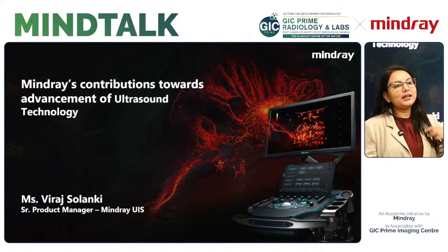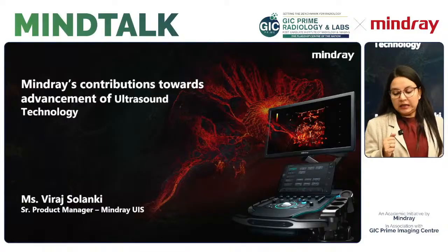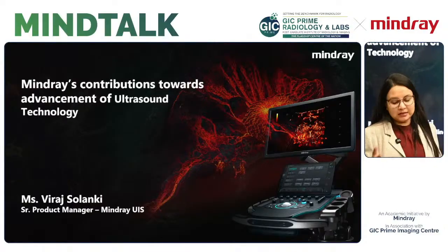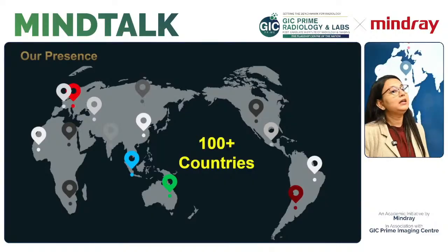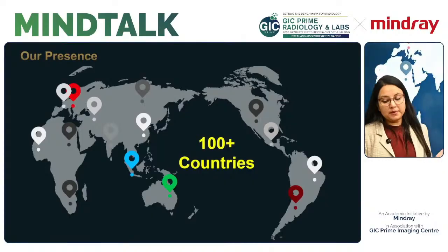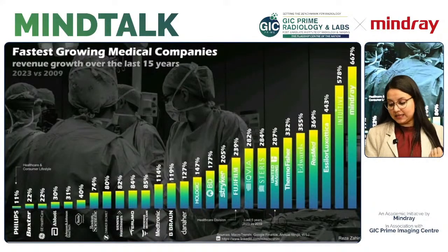Today, I will be sharing a small presentation of Mindray's journey and what technology we are bringing to this fraternity. In terms of our global presence, we are present in more than 100 countries, and we are the fastest growing company, as you can see from where we are standing here.